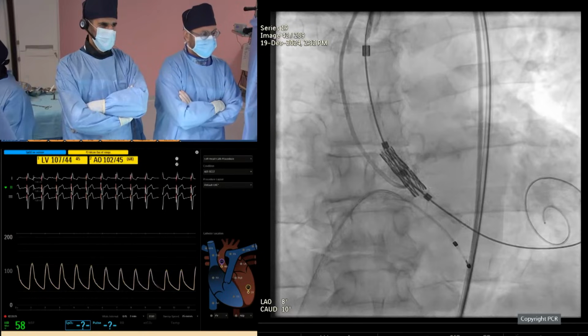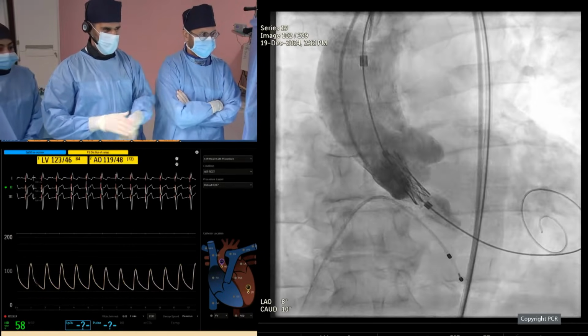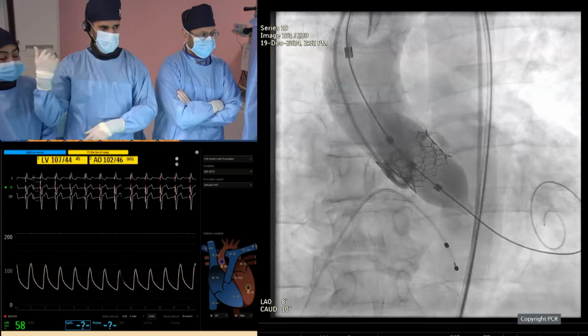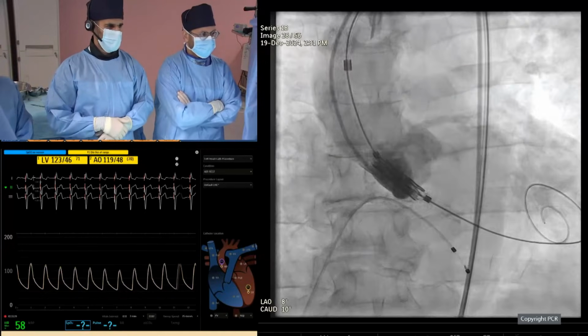So as you noticed, Dr. Hatem just immediately asked us to deploy because the patient was a little bit hemodynamically unstable. And there was one before that as well. Can we just go to the one before, while you were positioning it? Yeah, that's this one. Here.